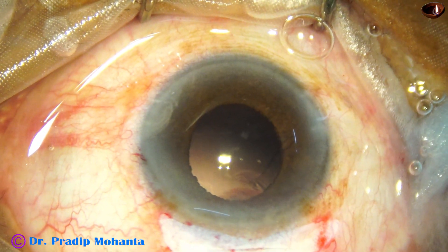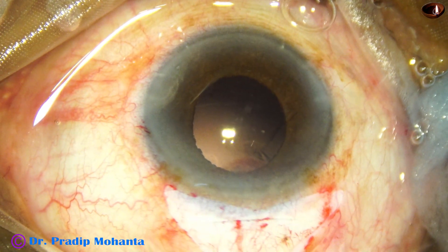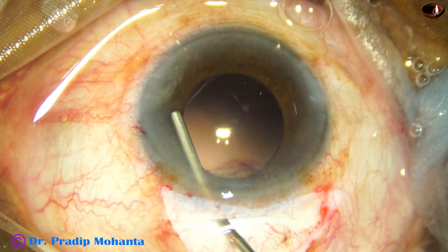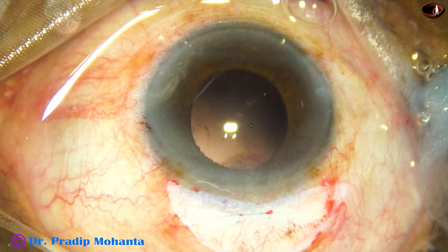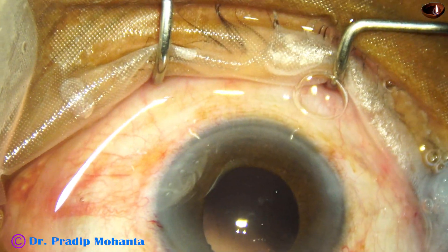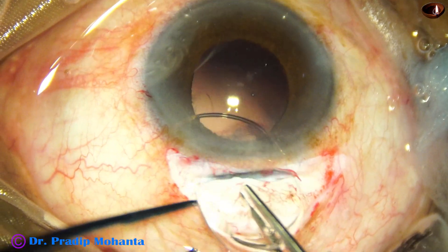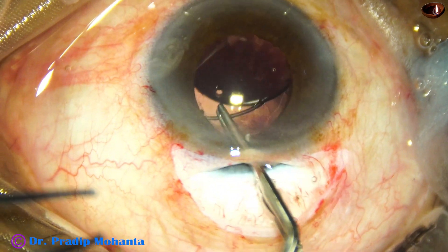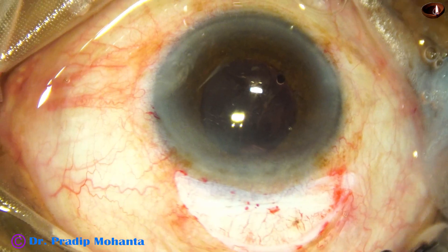Going through the side port, I removed some cortex from 1 o'clock and 2 o'clock. Now is the time to implant the lens. The anterior chamber and the capsular bag are filled up with 2% hydroxypropyl methylcellulose. In this case, I am going to implant a PMMA lens with a 6-millimeter optic. The leading haptic goes into the capsular bag and the trailing haptic is also placed in the capsular bag using McPherson's forceps.